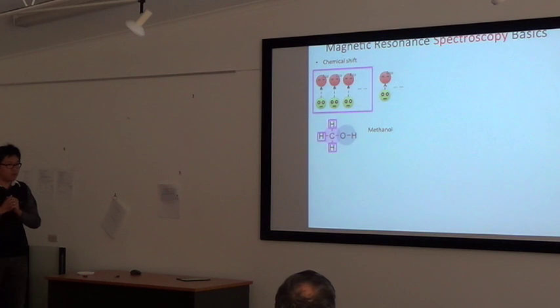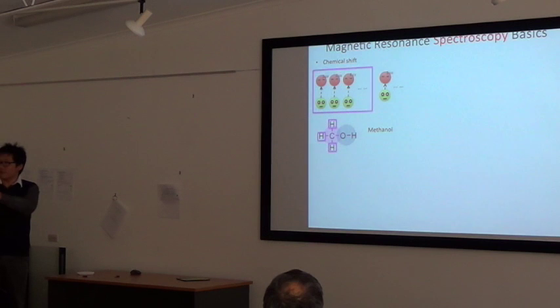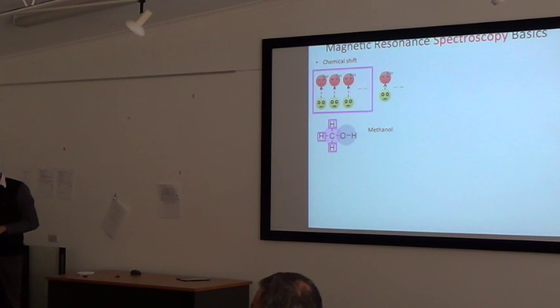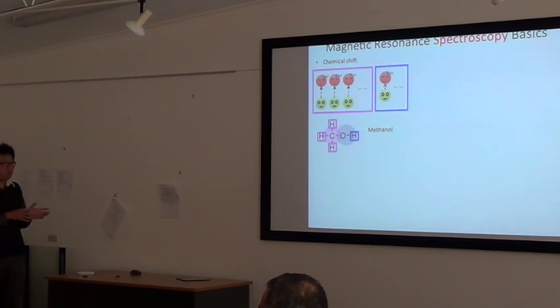Those three of them share the same type of local magnetic field, and they have a relatively longer excitation period. It's like these three people are under air conditioning, and the chilly weather makes them stay awake a longer time. And the blue one is in a different local magnetic field, which gives it a much quicker relaxation period.